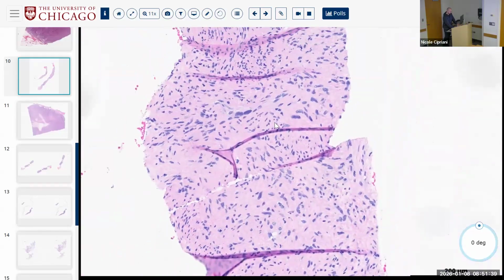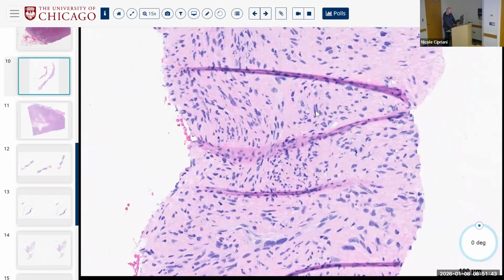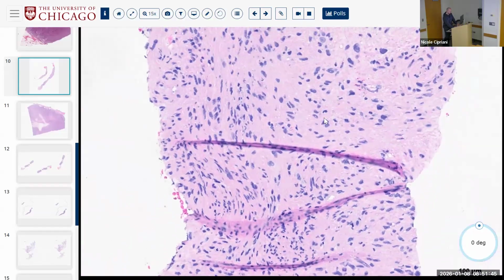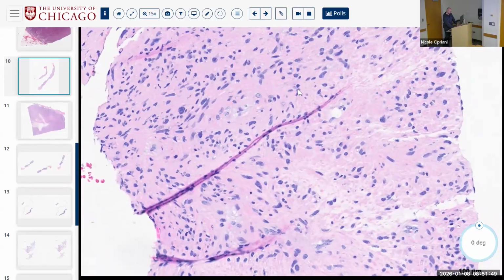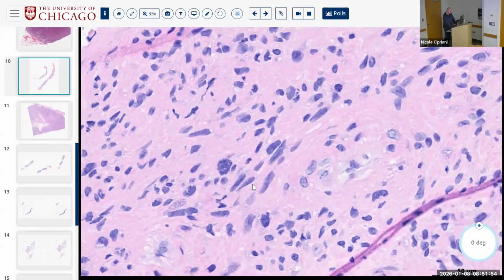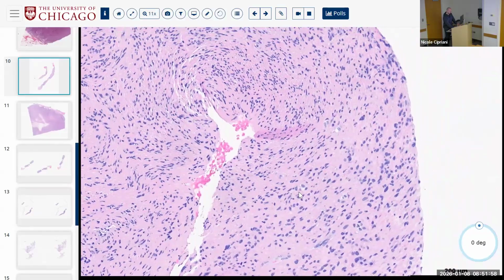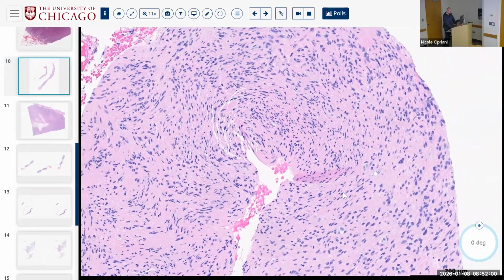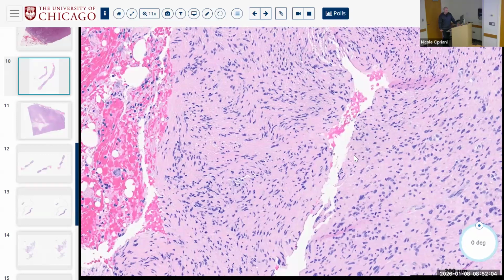So generally the perivascular myoid stuff is either extremely bland and sort of round cell glomoid, or if it has mature myoid elements, usually there are some immature glomoid elements. Or if it's all mature myoid, you wouldn't expect this much pleomorphism, right? So unless it's a malignant variant, but those are vanishingly rare. So I'm thinking something more sort of true smooth muscle, okay?